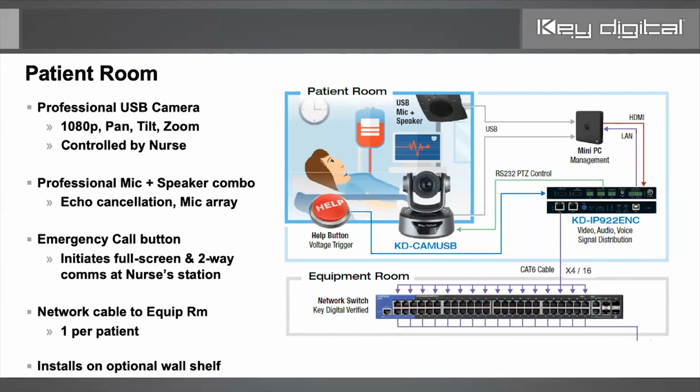In actuality, everyone that we have truly deployed has been a custom fit solution. We had one with 8 patients, audio and video, plus 18 audio only, for example. And that requires a good amount of discussion between Key Digital and the integrator, and sometimes the end user, as I alluded to earlier.